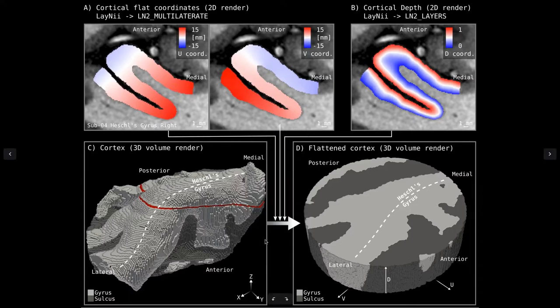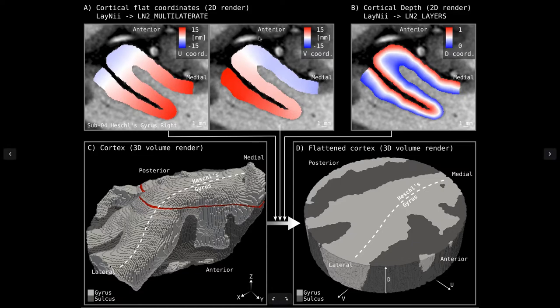Our aim is to transform from a folded brain chunk to a flattened version of the brain. To perform this operation, first we need to compute the depth of the gray matter voxels and also the other two axes that are orthogonal to the depth of the gray matter voxels — the u and v axes as we call them.